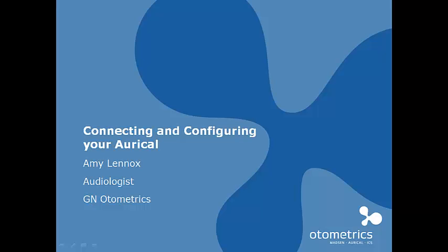Hi, my name is Amy Lennox and I'm the audiologist with Otometrics Australia. I'm just going to go through how to connect and configure your Aurical to the OtoSuite.